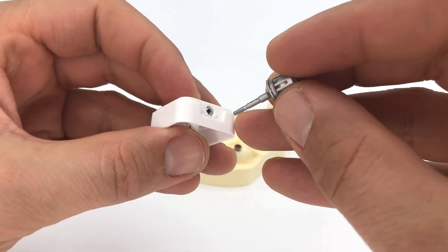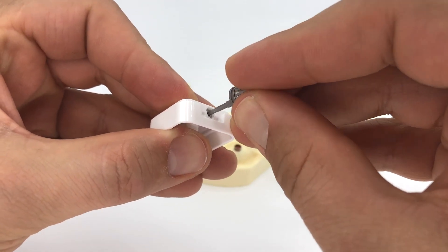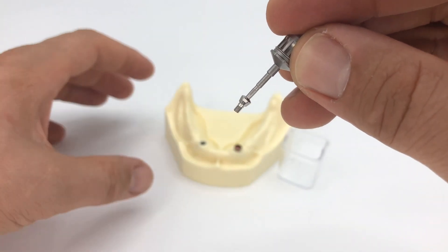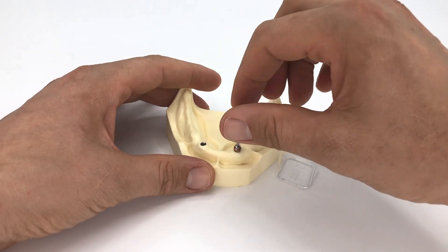Now you are ready for the final step: cover the implant with the cover screw, which is placed in the base of the tripod. Use the prosthetic driver, push it into the cover screw, and pull it out. Then hand-tighten the cover screw into the implant in the patient's mouth.